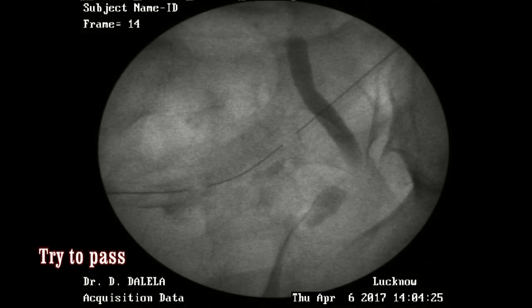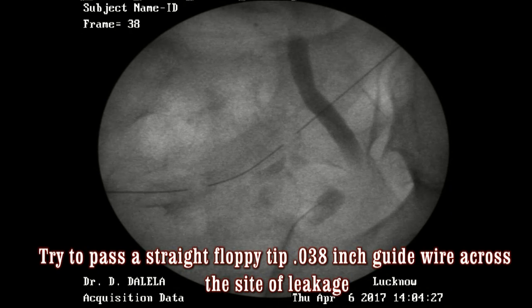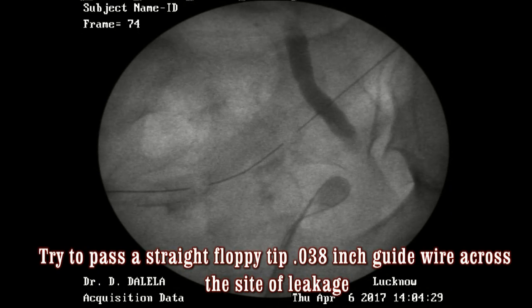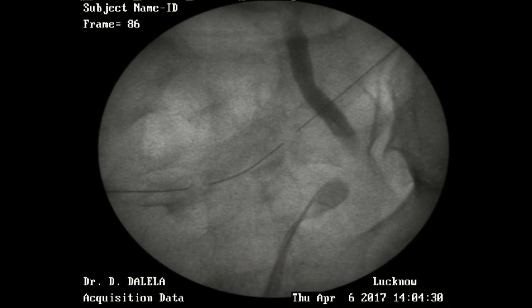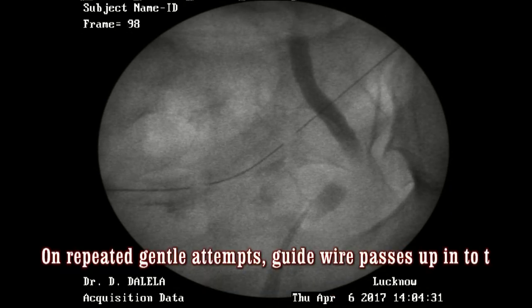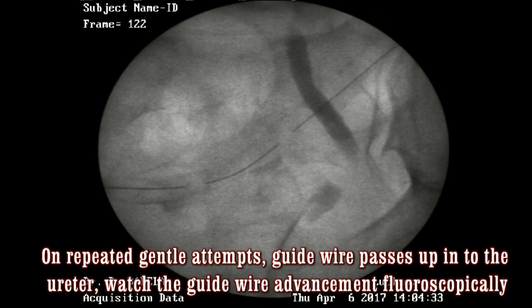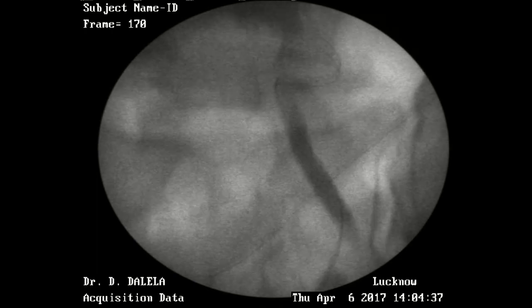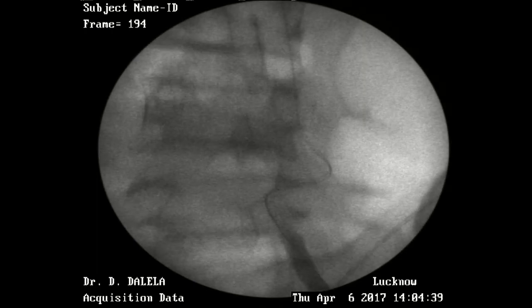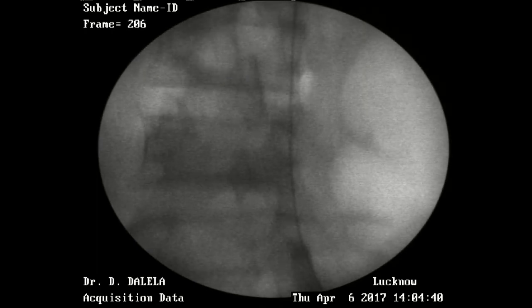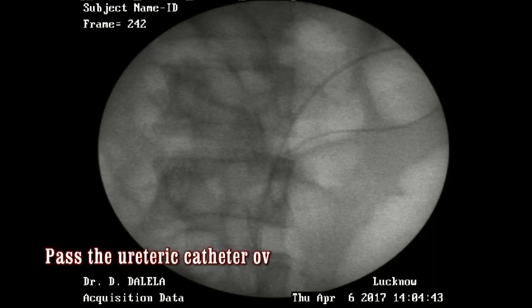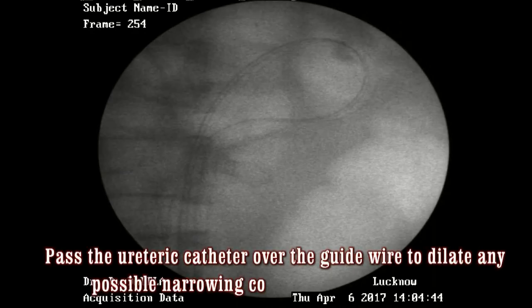Next, you try to pass a straight floppy-tip 0.038 inch guide wire through the area of the leakage in the ureter. You may need to make a few gentle attempts to pass the wire. The wire will then bypass this area of leakage and will go up into the renal pelvis and coil there.